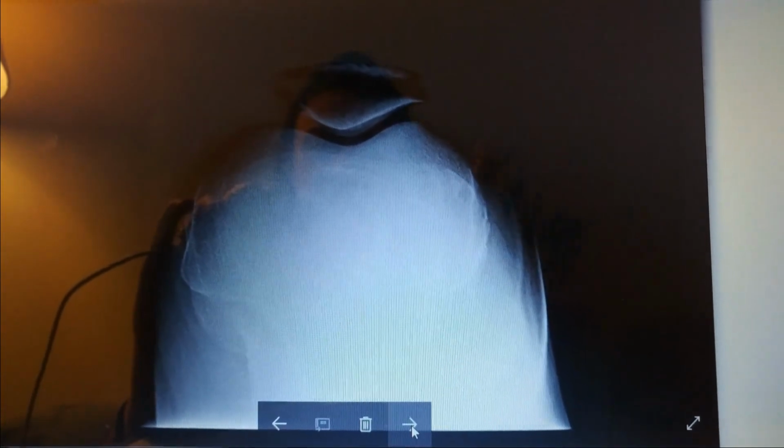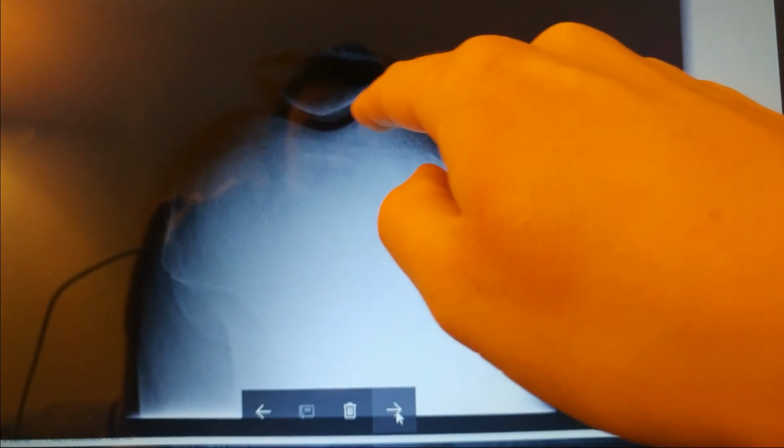And here we have the tangential projection of the patella. We're interested in the patella for this one here. So the central ray enters perpendicularly to the joint space between the patella and femoral condyles. And you can see the intercondylar sulcus here, that should be open.